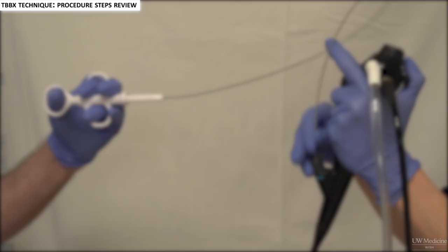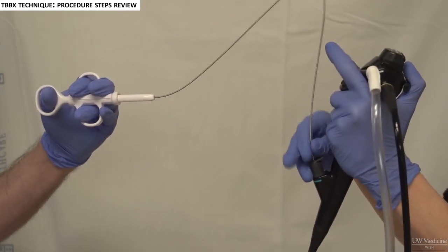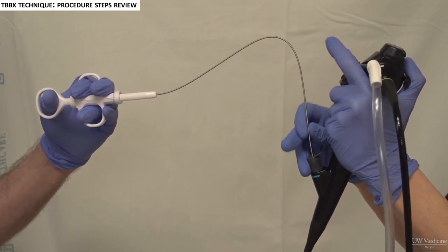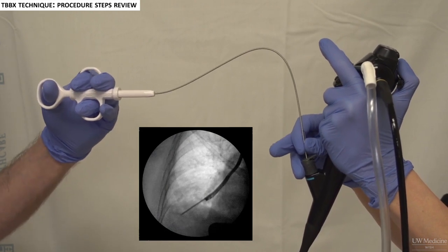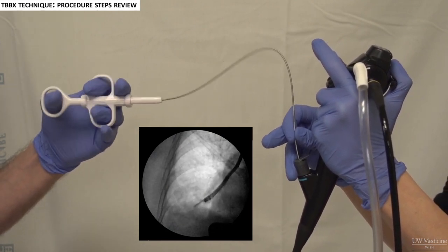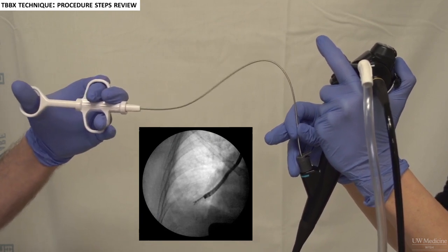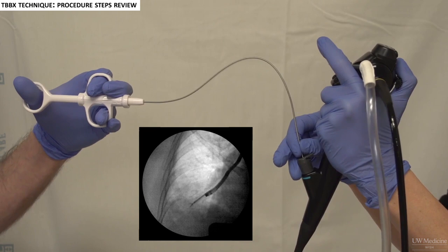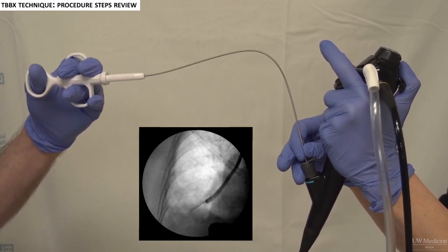Okay, we've gone through all the steps for taking transbronchial biopsies. Now let's review them. First, get in position. Then insert the forceps until you meet resistance. Then retract the forceps a couple of centimeters. Next, open the forceps, and pass the open forceps a shorter distance than before and until you feel gentle resistance. Then close the forceps, pause for a moment, and then retract.